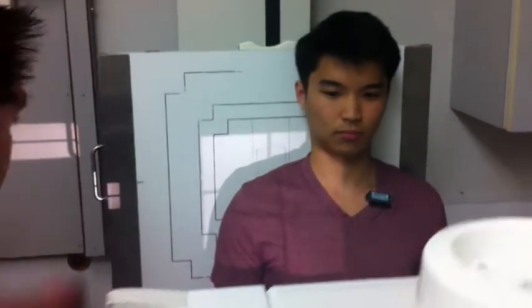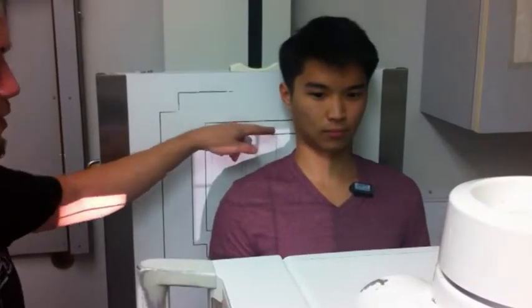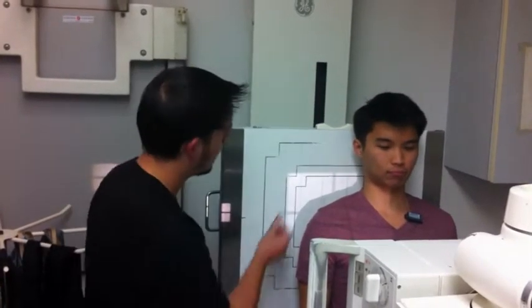Another thing too, you want a little bit of light over his shoulder as well, about 1 inch. And then you want to put your right marker, since his right shoulder is the affected side, right there above.